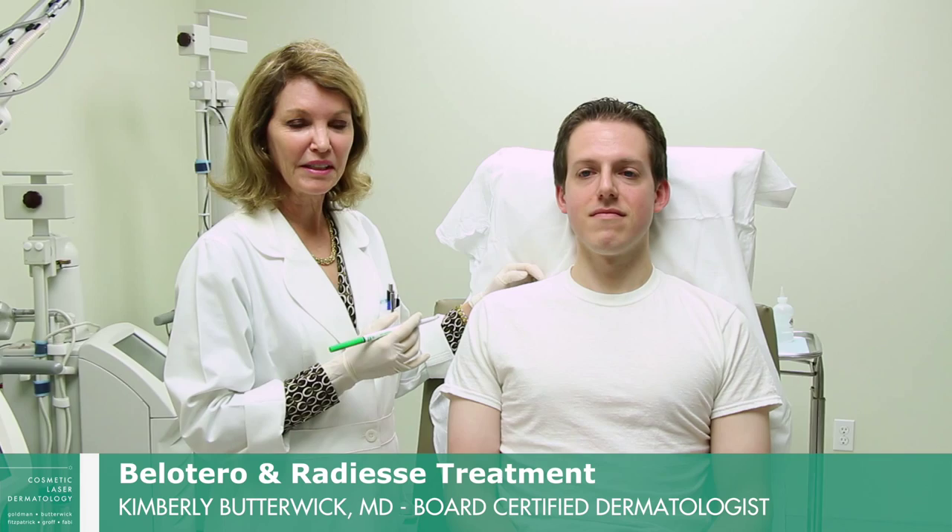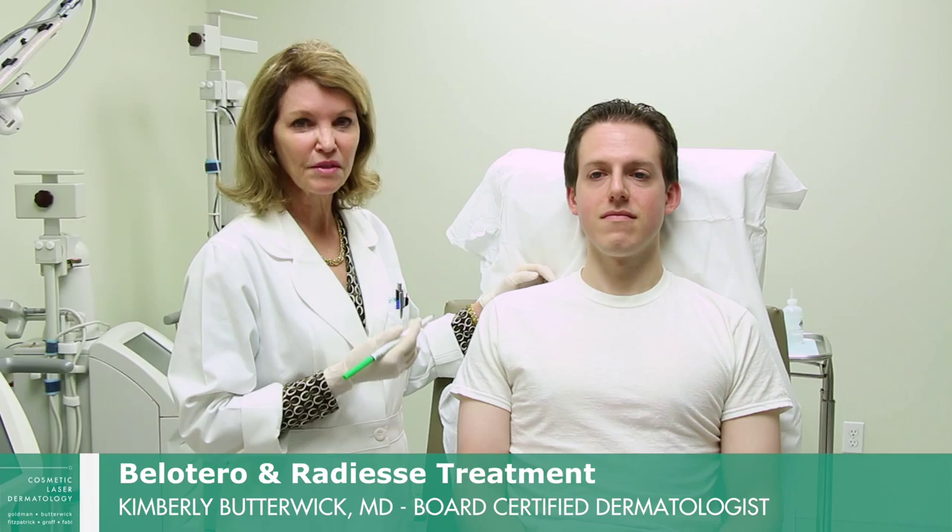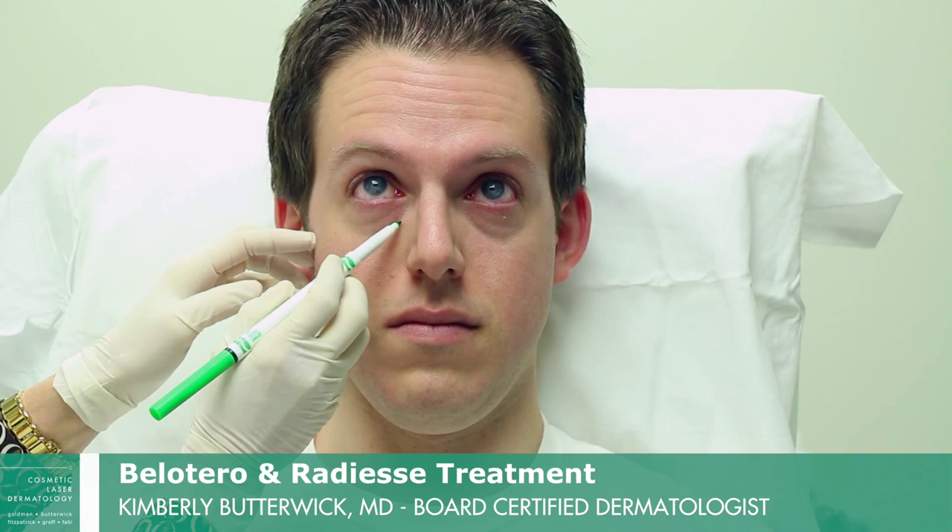Hi, I'm Dr. Butterwick, and today I'm going to show you filling in a young male patient. He's in his early 30s, but there's already some signs of fatigue, and he also has some facial asymmetry that we hope to correct today.